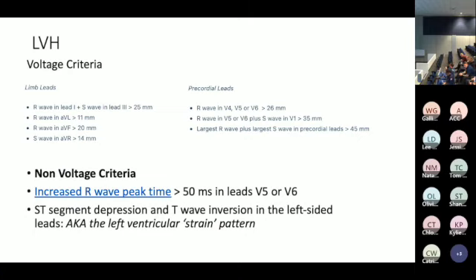Definitely. I guess the point is that all of these are ones that make you think probably a STEMI and then it turns out to be something else, or vice versa. But definitely not saying to dismiss it or anything. You want to assess and get some further information and speak to cardiology and all of those things.